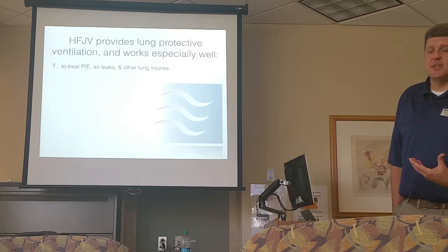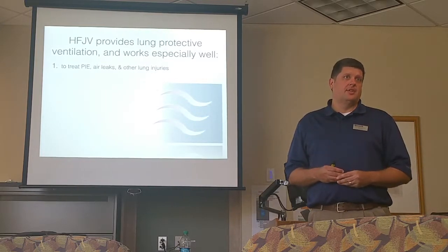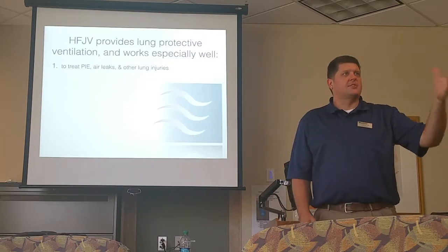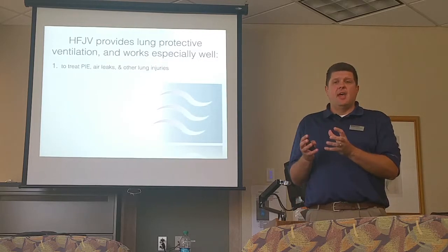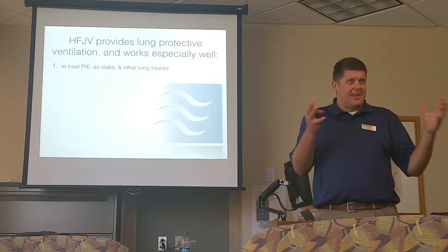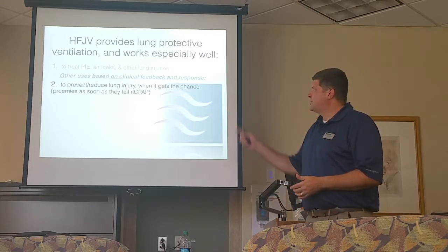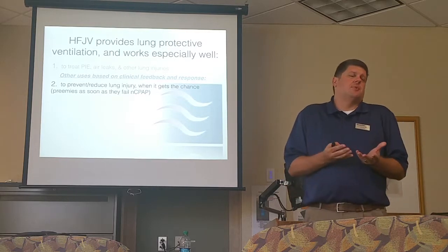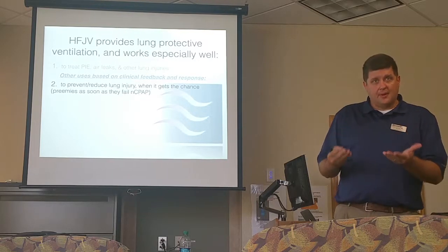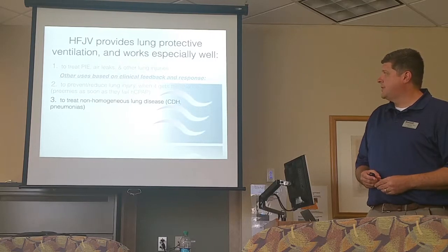And at many facilities I visit, at the first sign of gas trapping and overinflation, they think about bringing the jet out of the closet. They don't wait for the CO2 to get to 120 before they do it. They see the x-ray, they see these changes starting to take place, and then they're not in a rescue mode mentality. They're in a position of maintaining and controlling, if you will. And that's where sooner rather than later comes into play, which is why number two, these machines were invented to prevent lung injury, not just treat it. And so again, earlier is better for these patients, for our little babies that we take care of. We can reduce that lung injury.